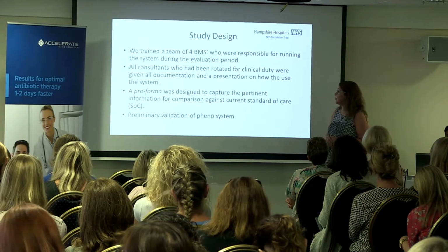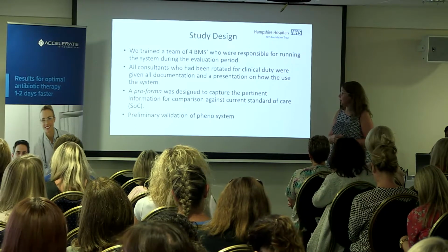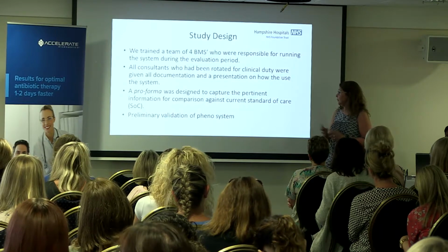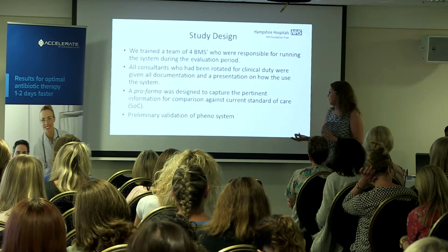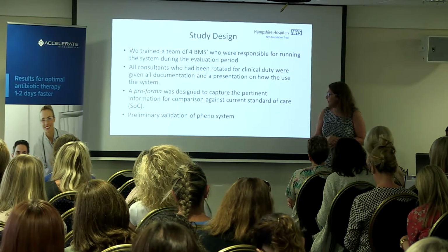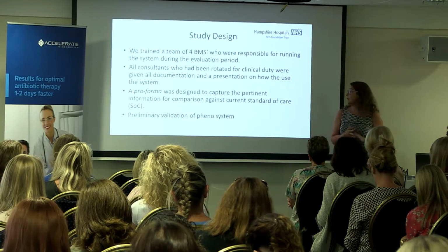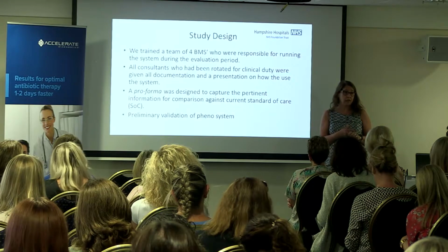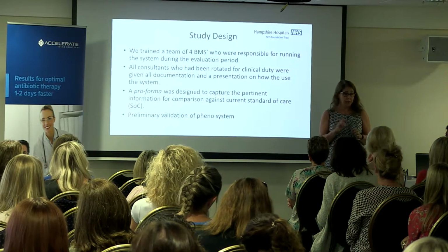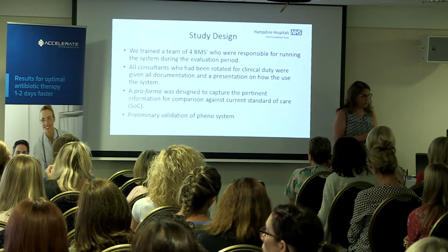All the consultants in the department were given documentation on what to do if a positive came up, and we designed a pro forma to see how it would have affected standard care. Before we ran it, we did a preliminary validation of the Pheno system, so we analysed the company validation data. We gave some mixed samples that we spiked with single organisms, and we ran it in parallel with some clinical samples just to make sure we were happy that the system worked.